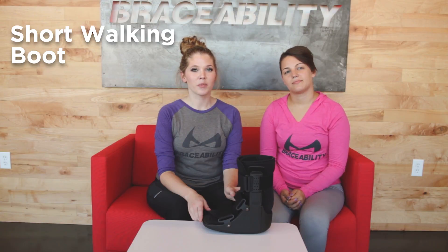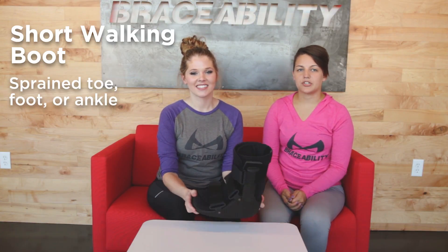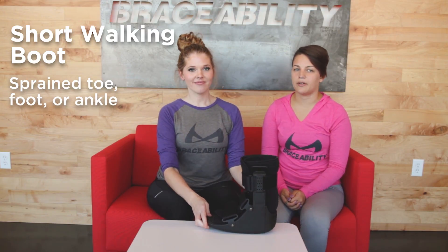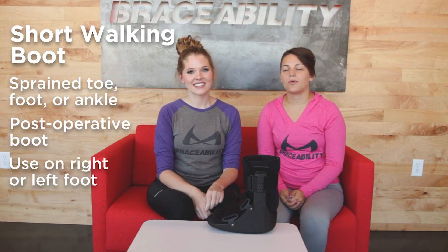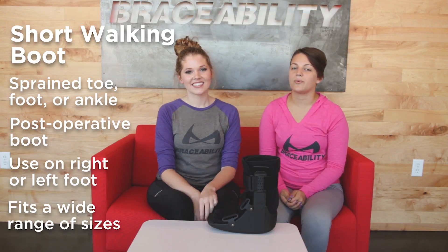Hi everybody, I'm Jenny and I'm Morgan, and today we're going to be talking about our super affordable short walking boot and why it's one of the best boots on the market today. This boot can help treat many injuries such as a sprained or partially fractured toe, foot, or ankle. Plus it can be used as a post-operative boot. It can also be worn on your right or left foot and is available in many sizes that fit men, women, and kids.